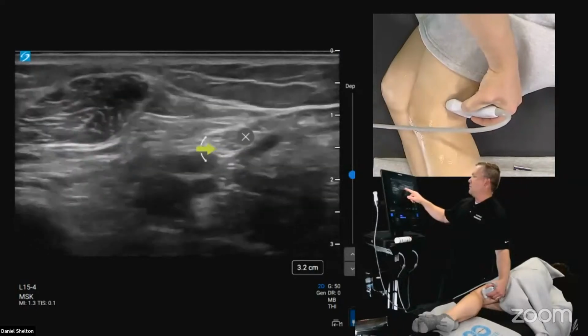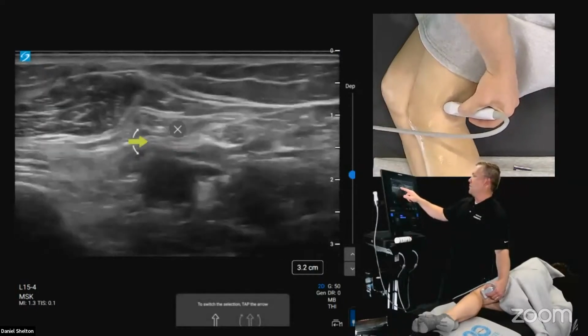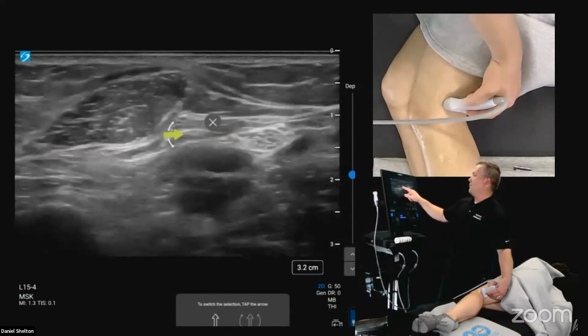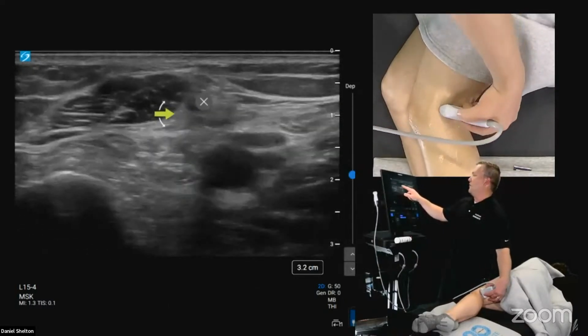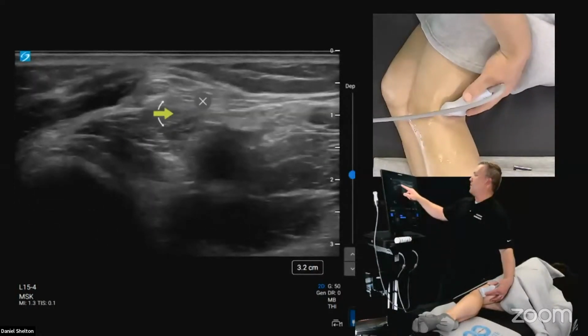Right there. Actually, tibial. That was tibial. Here's peroneal or fibular. And as it dives upward, remember I have to angle acutely north. So look at how far up I'm burying my transducer handle to catch that.